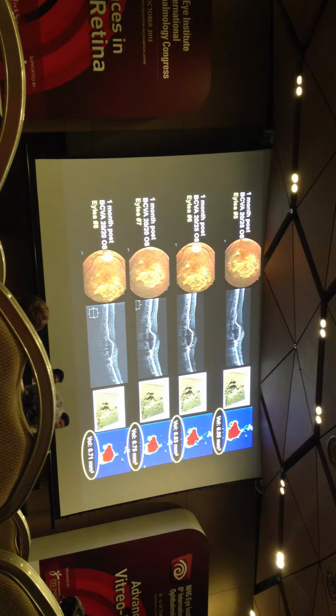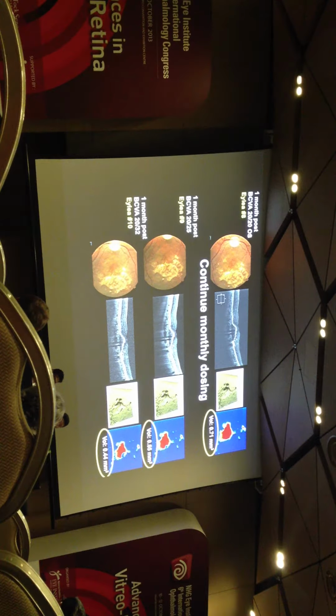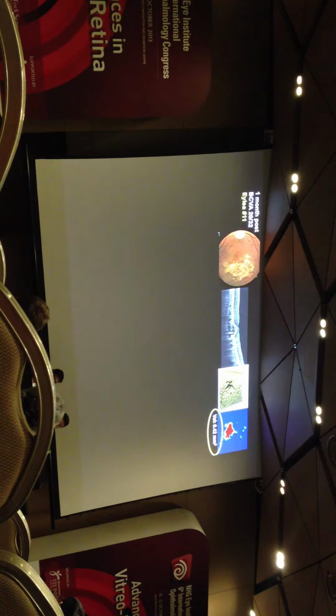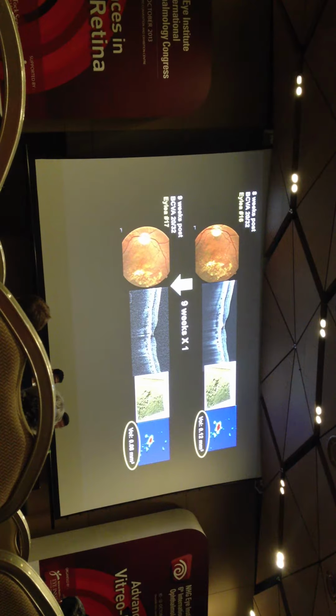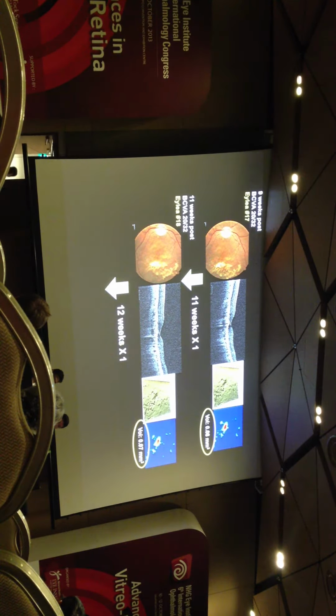So I've learned my lesson. I'm going to continue treating monthly and see if it keeps dropping. It keeps dropping. Okay, let's keep going. Looking good. Consider extending to 5 to 6 weeks. 6 weeks, did that twice. 8 weeks twice. Still dropping. Looking good. 9 weeks. Dropping. 11 weeks. 12 weeks. And that's where we are now. We're seeing the patient back in 12 weeks.